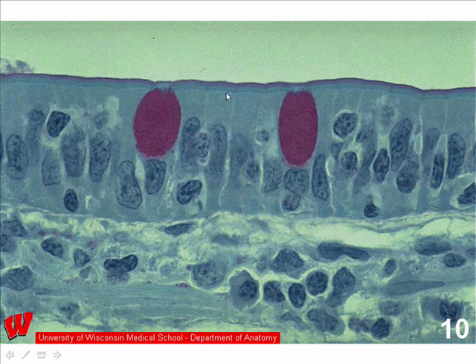And then at the top you'll note that it's fairly complex. There are multiple lines here that are showing up in this staining. Also, there are different types of cells. So there's the simple columnar cell, and then there's this other columnar cell which clearly has an accumulation of material in its apical cytoplasm. This is called a goblet cell, which secretes mucus onto the surface of the epithelium. The other cells are the absorptive cells in the gut.